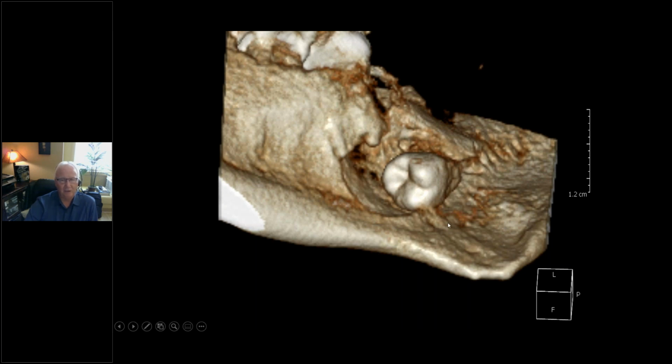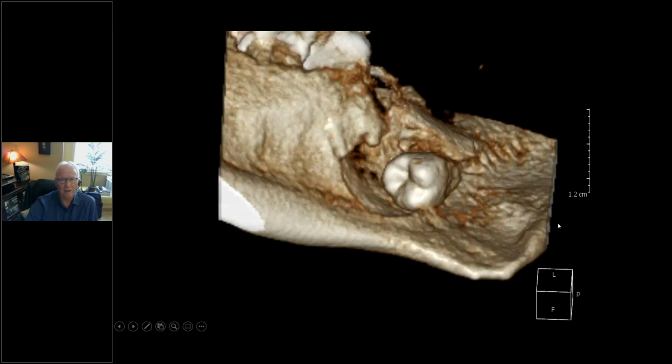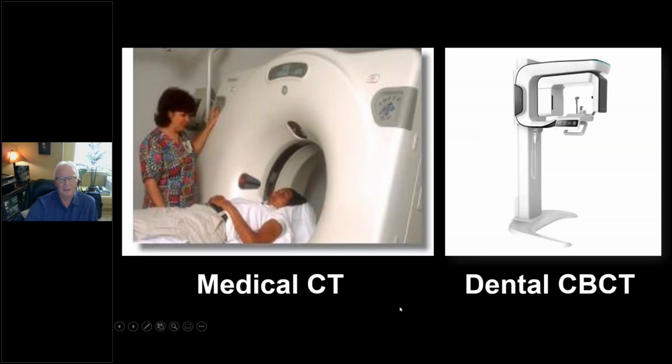It's actually a different patient, but similar impaction. And you can see the occlusal surface. You can see the morphology of the developmental grooves in the tooth. And in some software, in the one I use, I have an endoscopy tool, a virtual endoscope. So this is the same image with much higher resolution, color, and much more detail in the impacted tooth itself. That turned out to be an odontogenic keratocyst, and so did that. So it was good to put the two together.